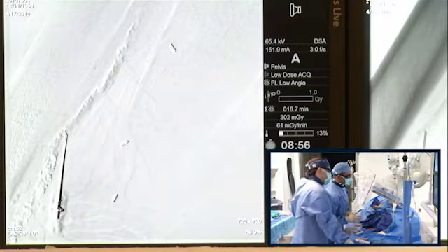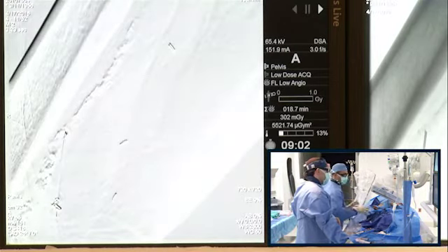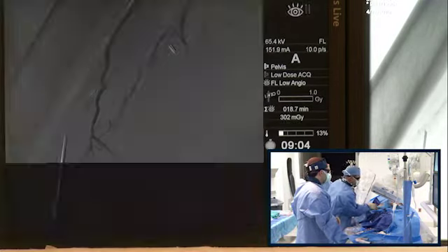Yeah, so it's heavily calcified, severely diseased, and our sheath is kind of stuck in the iliac area. So we can't bring the sheath down, so that's part of the reason. But we'll get this, just give us a second. Yeah, don't hurry. Okay, we now got it. So you know the flow, and I think this should be it, hopefully.